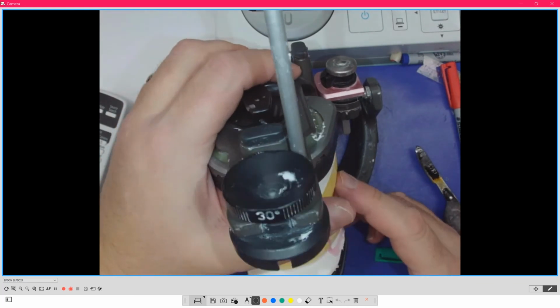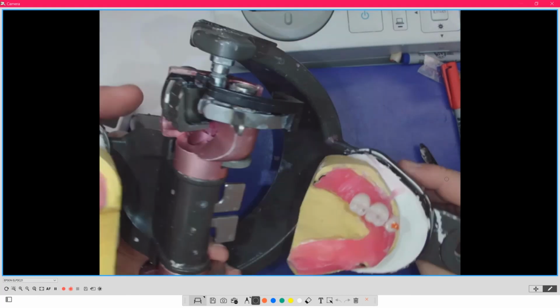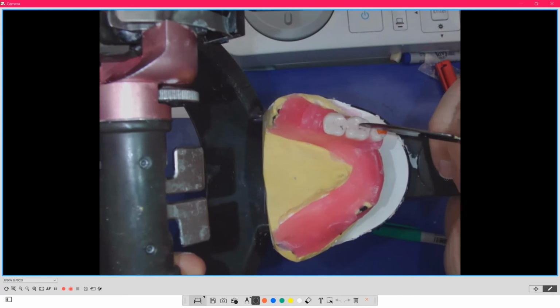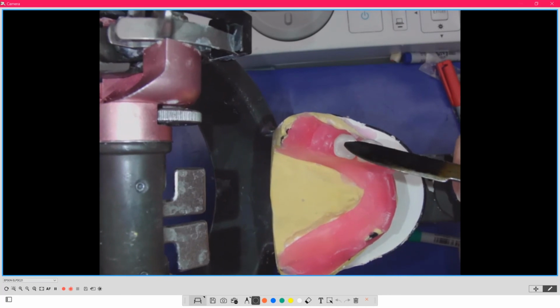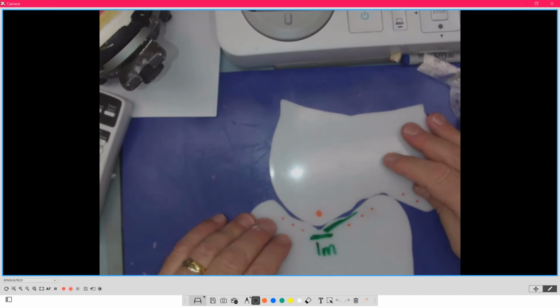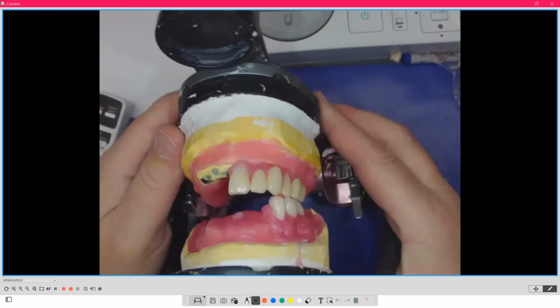And again, regardless of your articulator, do a chew cycle, left and right. Some kind of a chew cycle. And then I am looking for, look at that, touches on the guiding planes. So there's one right there. See that? There's one right there. There's one right there. Again, it's a little hard to see on the video, which I'm sorry, but they're there. And so that was the hit and slide. I caught a hit and slide where it hit and slid into position. So that's what those marks are, showing it to you on the real thing.